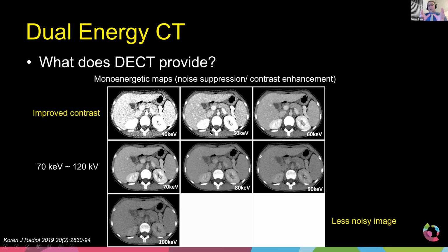So this is the one area I think for pediatrics where it makes the most sense. A, we could maybe dial down the amount of contrast that we inject, and we could just have more information for you, the radiologist, to look at. Obviously, you're all busy. You're already looking at hundreds of images in single energy. Do you want to look at another 400 or 500 images in multi-energy? That's something we have to figure out.